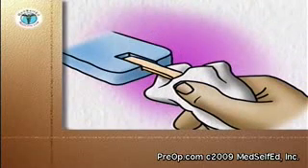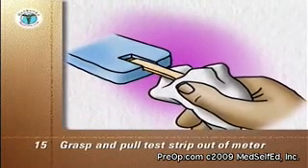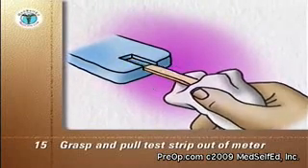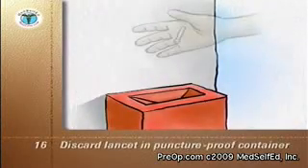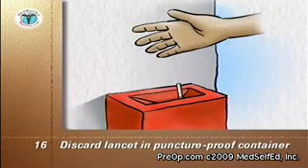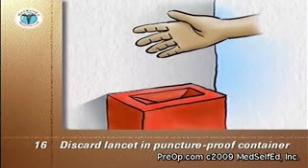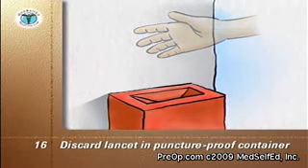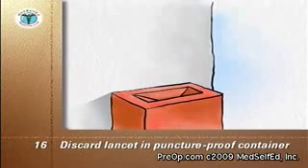Once the blood sugar reading on the meter is complete, use the tissue to grasp the test strip and pull it out of the meter. This usually turns the meter off. Discard the lancet in its protective cover and the used strip into a glass or puncture-proof container with a screw top or a Sharps container purchased from your local pharmacy. Replace the cap on the container. When the container is full, cap it and discard it into the trash.